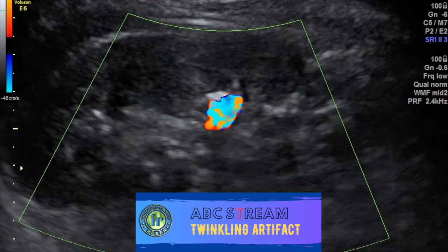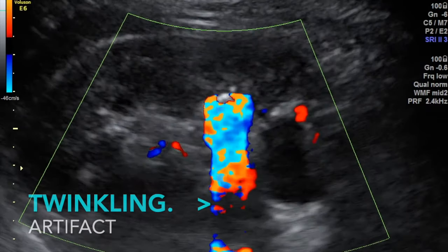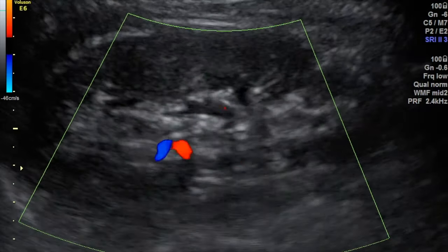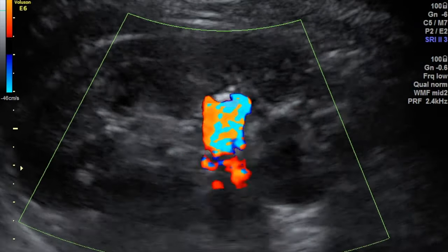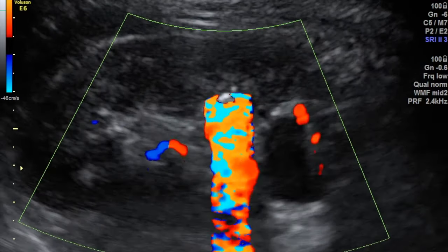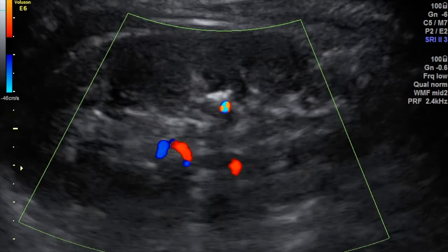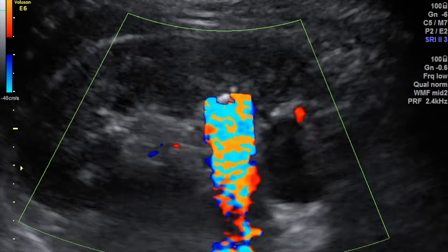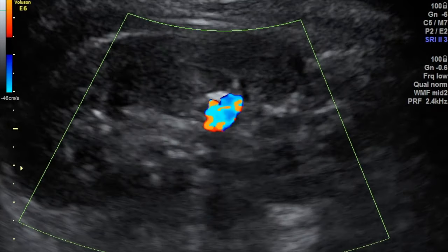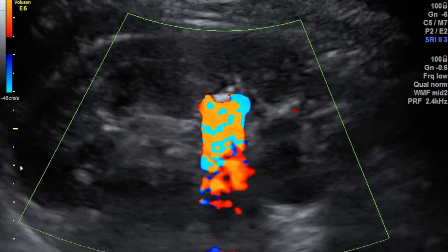The T in ABC STREAM is the twinkling artifact, which is a color Doppler artifact. The concept is similar to acoustic shadowing on regular ultrasound. On Doppler, we see a focus of alternating colors behind the reflective object — usually a calculus — giving an appearance of turbulent blood flow. Knowing this artifact, you can switch on color Doppler when hunting for small stones, and you will see a small twinkle distal to the calculus, confirming your diagnosis. The artifact becomes more obvious when the focal zone is located below the reflecting surface.